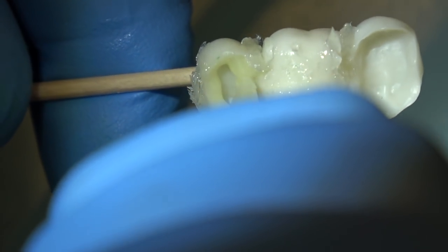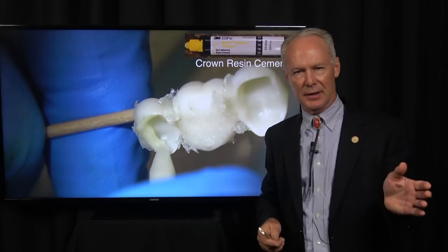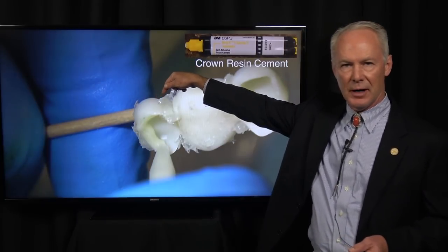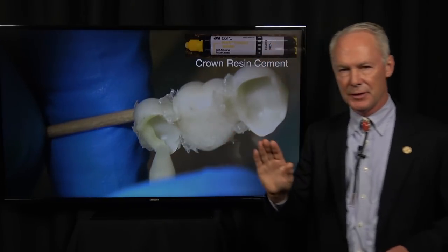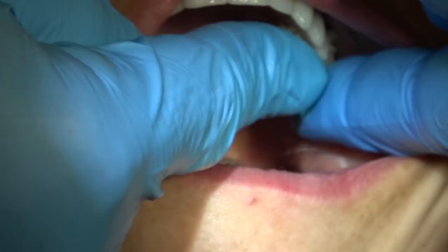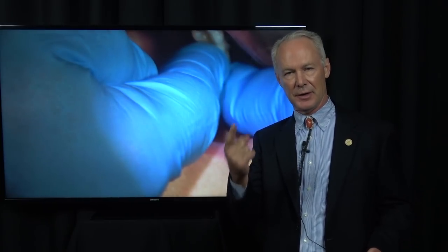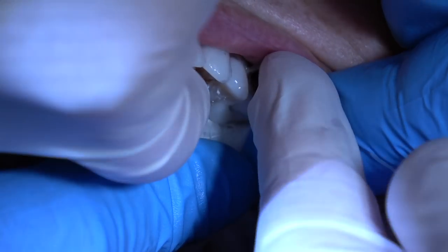You only squirt the cement around the edges of the crown — don't fill it up or it won't seat completely. Back in the day, dentists would make a vent hole in the crown for cement to escape, but we don't do that anymore. Just put cement around the edges; it'll fill up the rest of the crown and the crown will seat. Push it slowly first to give the cement a chance to escape, then push forcefully. Tell the patient: I'm about to press very hard on this bridge, so you'll feel some pressure.